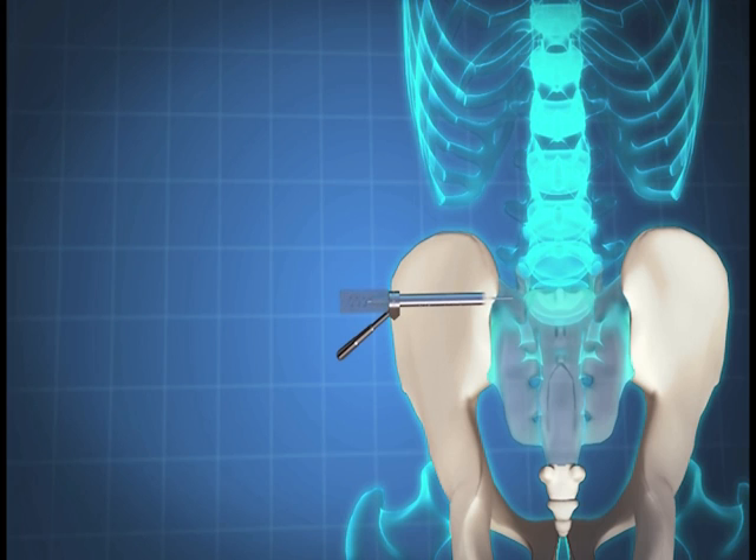Once determined, remove the drill gauge. Place the adjustable drill collar over the drill bit and set the collar to the previously selected Samba length. Connect the variable drill bit to the drill bit T-handle. Rotating the T-handle, a pilot hole is created with the drill bit just short of the tip of the Steinman pin. Once the desired depth is reached, remove the variable drill bit and Steinman pin.